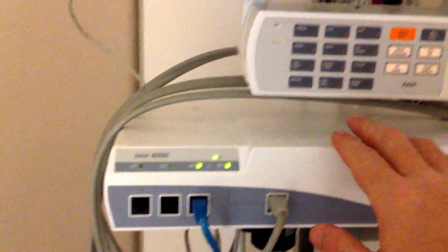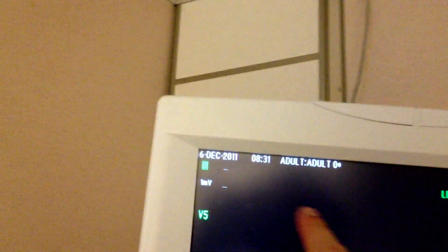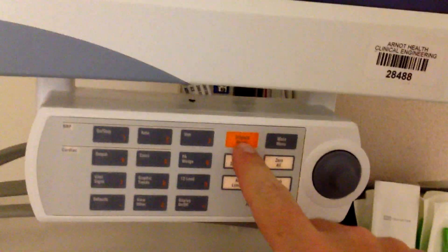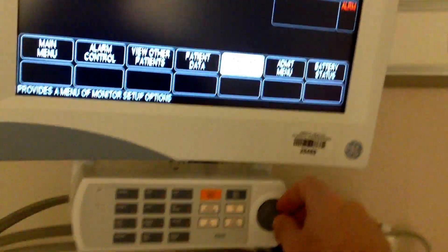Solar 8000i — turn it on, the display on/off. Today is December the 6th. Silence the alarm. We're going to get into the service mode; click on monitor setup.